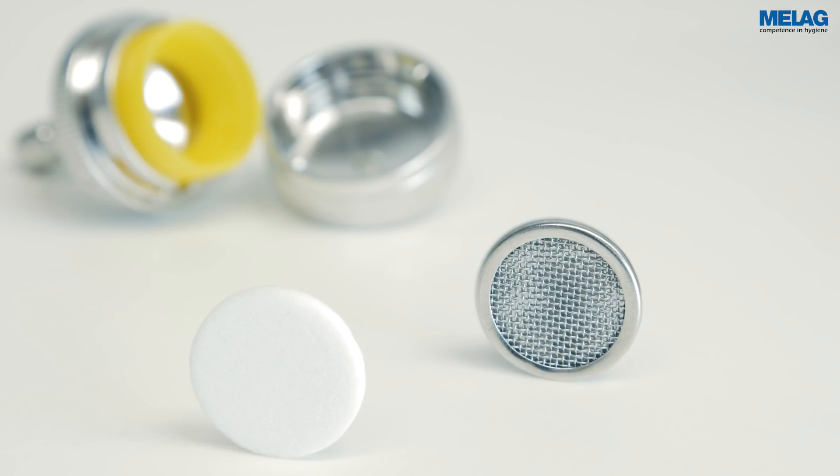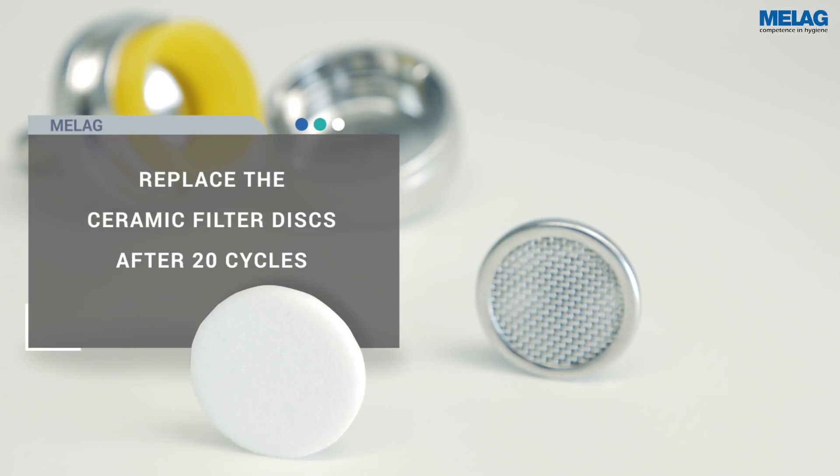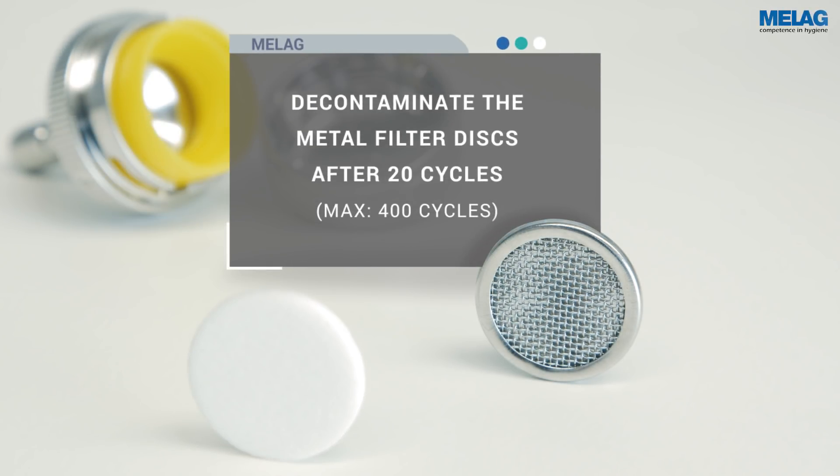You can use either a reusable metal filter disc or a ceramic filter disc to protect the instruments. Whereas the ceramic filter disc must be replaced after 20 cycles, the metal filter disc can be cleaned in the ultrasound bath after 20 cycles and then reused.